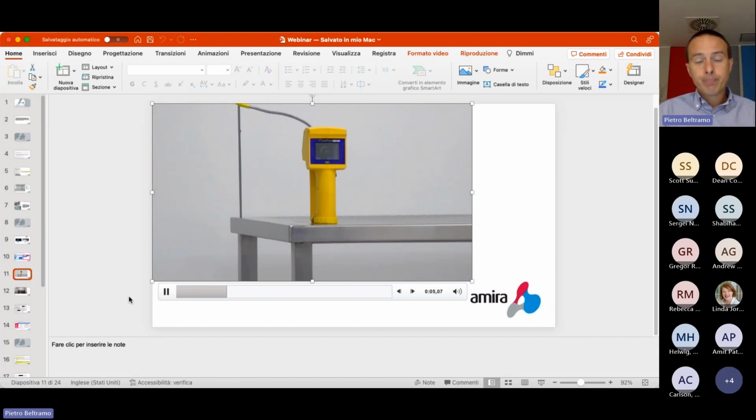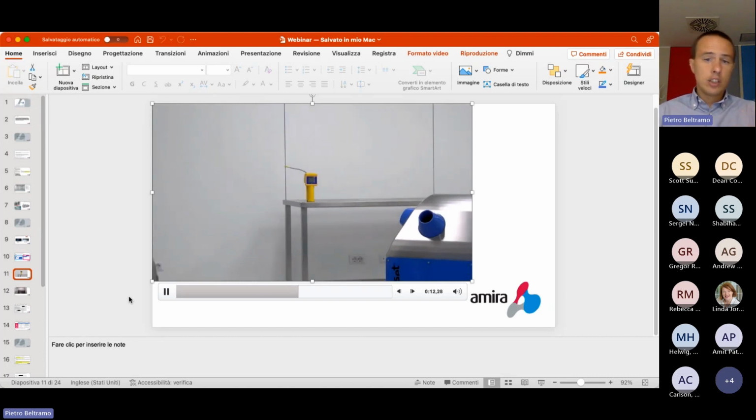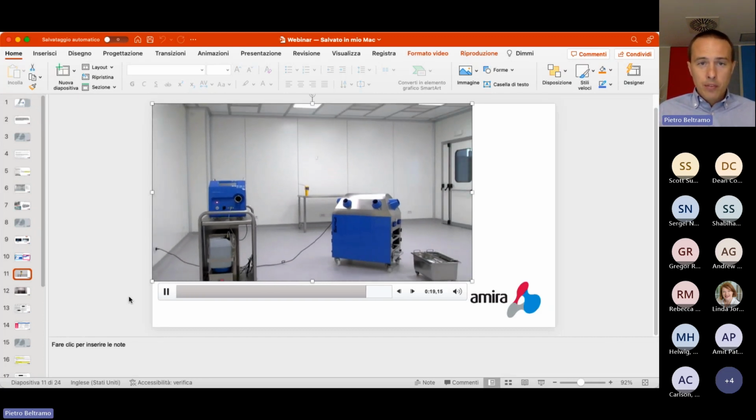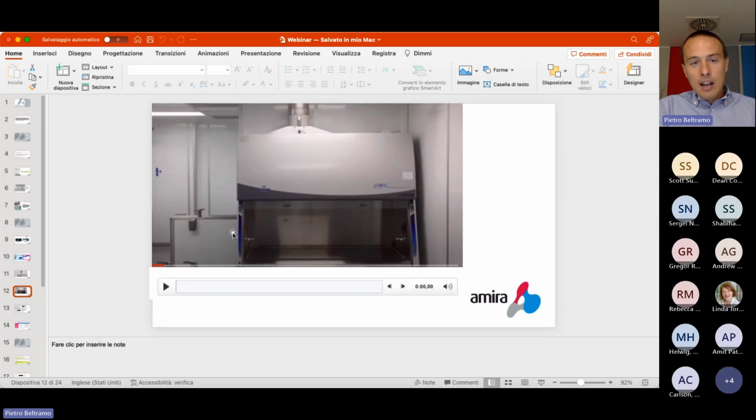And if you see the video, we'll now move the camera out, showing our equipment, showing you in the room. This is a distribution fan. This is our VHP machine. There's no trick made out of the video. This is just a simple camera, like the one that is showing you my non-beautiful face. And you can clearly see everything because it's a gas. When you wake up in the morning and you go for breakfast, you see everything with your eyes clearly and easily because you are submerged by the gas version of water. Okay. Now, what happens if I start?